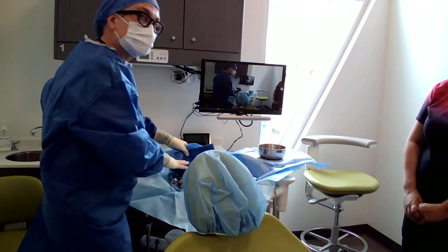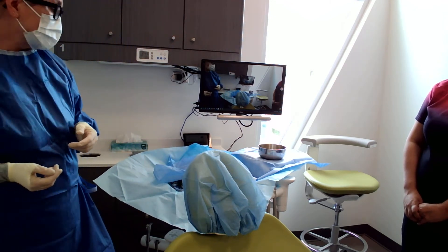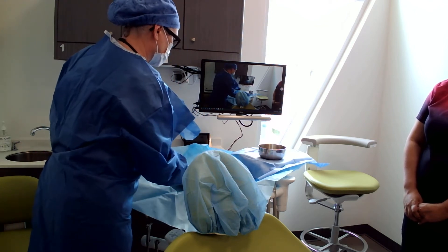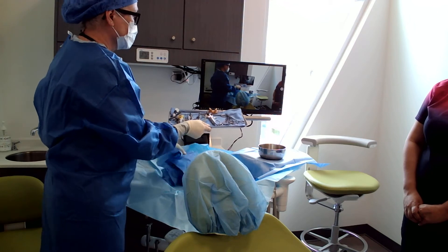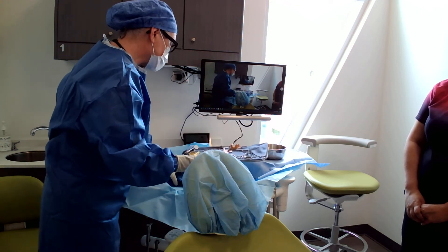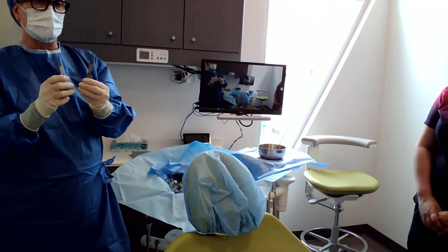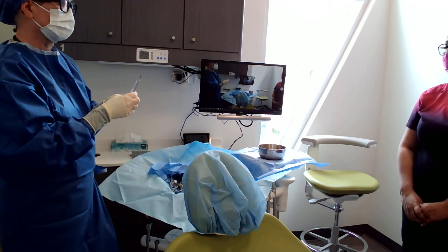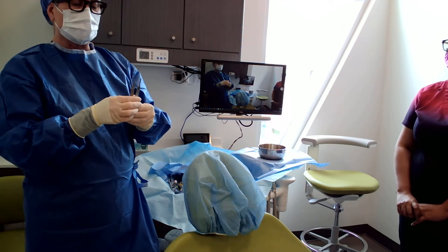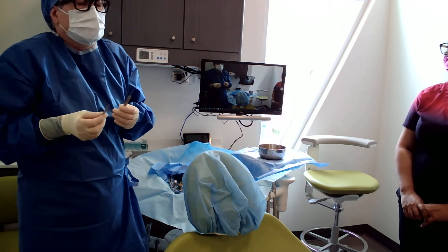On my tray I don't have any forceps or elevators — we're not taking out teeth, so I just have everything I need for the procedure. I have two blade handles: if a blade gets dull and the surgeon wants a new one, I can just hand it right over. Also, sometimes they want a 12 blade and a 15 blade, so I'll set up both or ask them which they prefer.